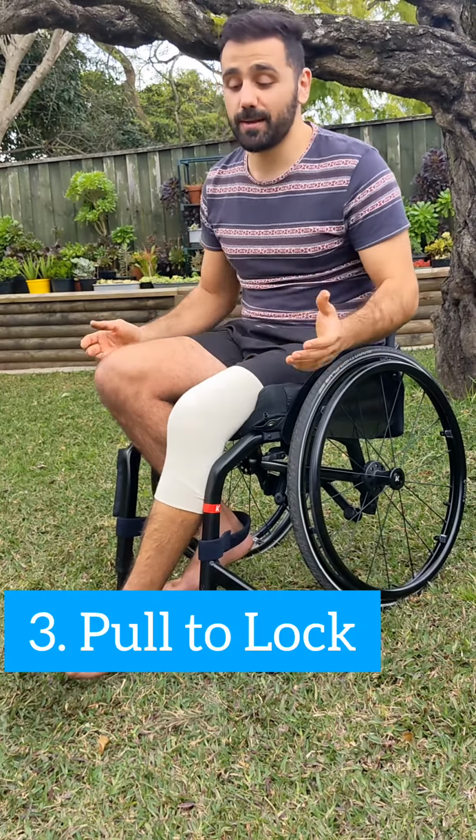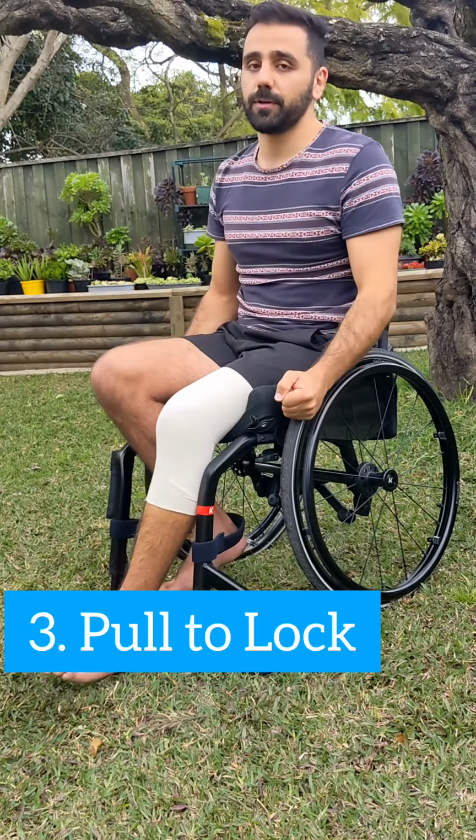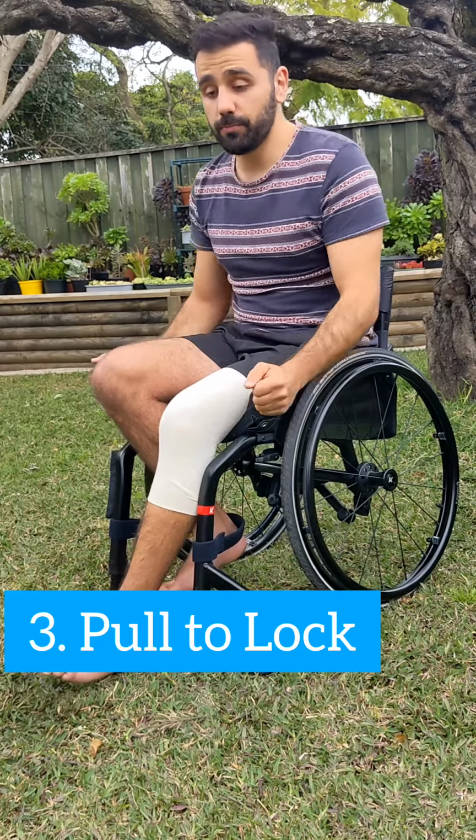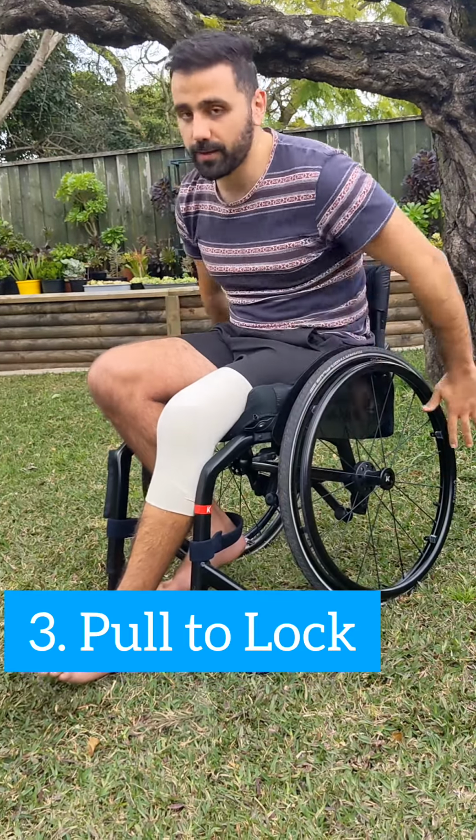Pull-to-lock brakes work the same as push-to-lock, but instead of pushing the lever down to lock them, you pull it to lock it. So what that means is that now when you push, the levers are stuck down and out of the way, giving your hands free range of motion.